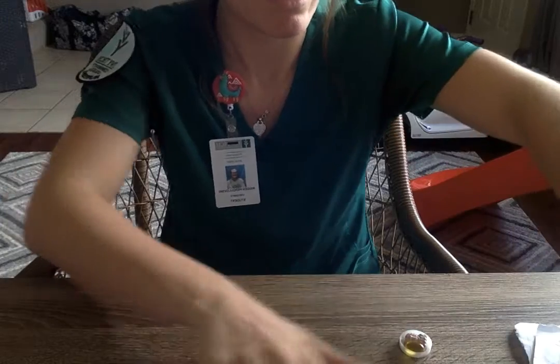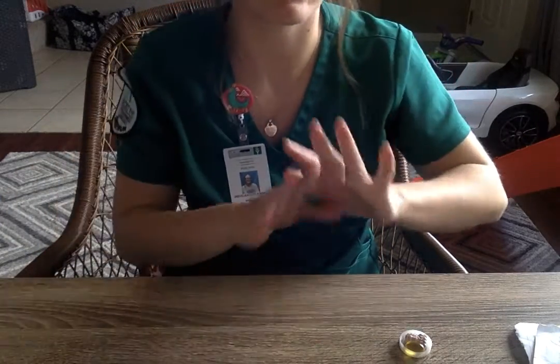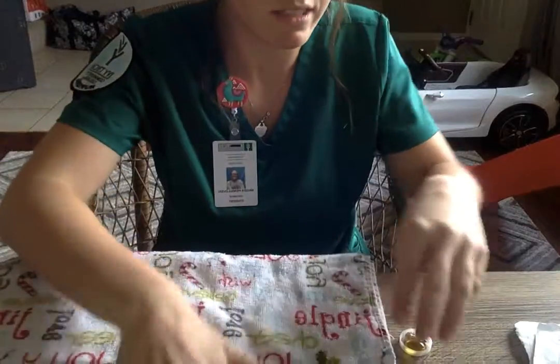Okay, so now that I have everything ready and everything is checked, I did my 3 checks, everything's going in the right place, I'm going to go ahead and get my patient ready and don my gloves.